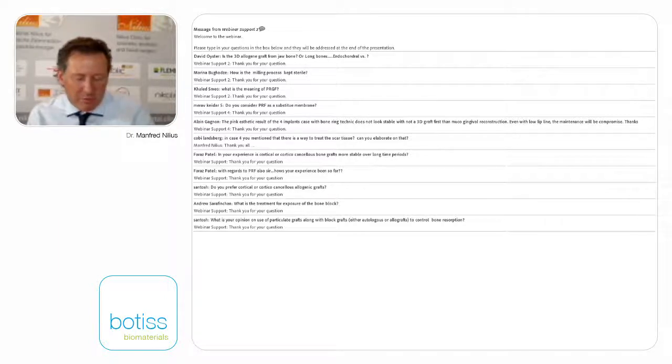My experience with the growth factor is not that good, because sometimes you also put in some inflammatory mediators and you have a big inflammatory infection. I say infection, but it's an inflammation. And when you have inflammation, the bone loss is going higher. So in this case, we only put in the first fibrin membrane.